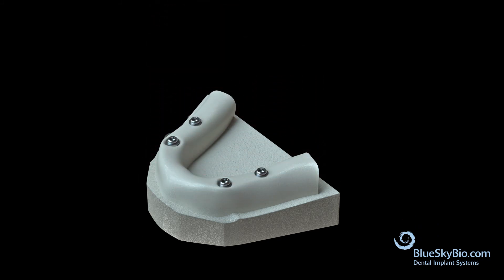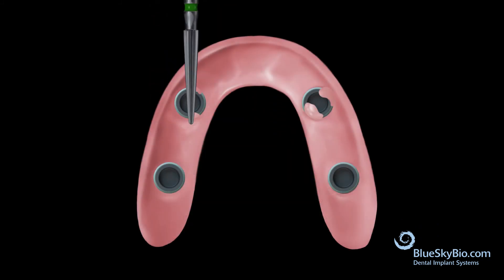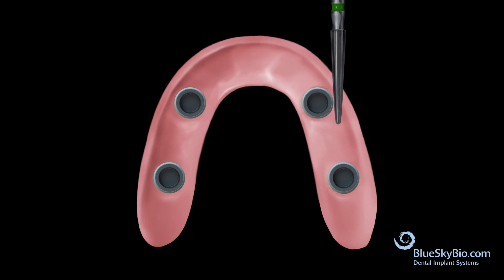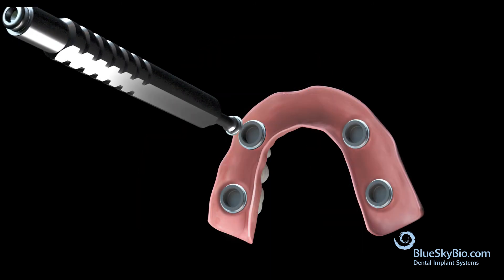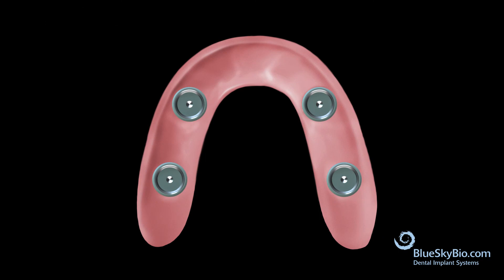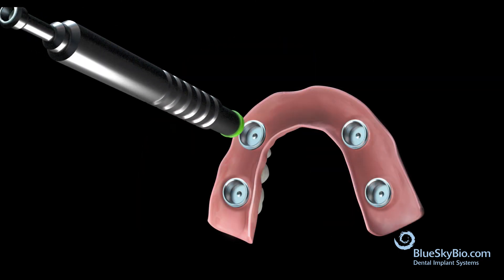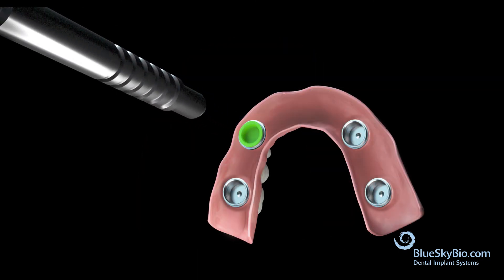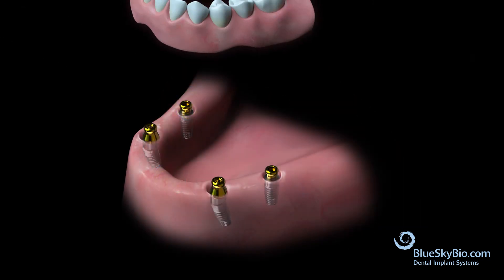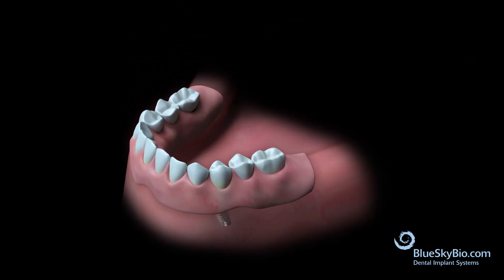Remove the denture from the mouth and trim any excess resin around the housing and ridge areas, then polish the denture. Use the insertion tool to remove the processing inserts and replace with the appropriate retentive inserts. Place the denture into the mouth and verify proper retention.